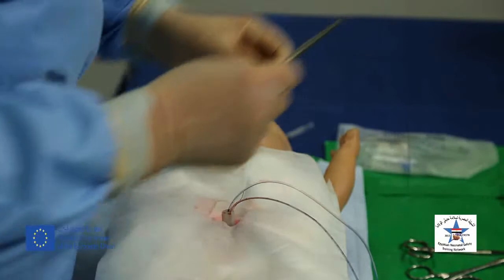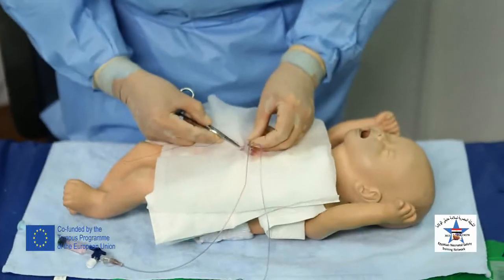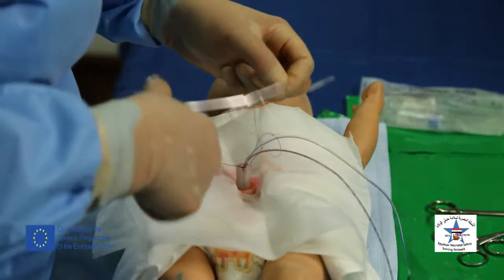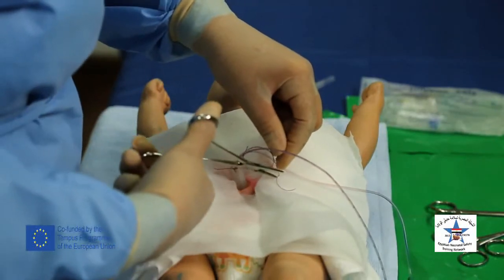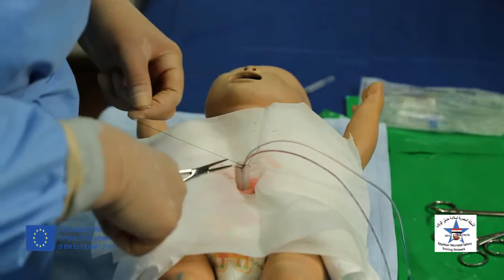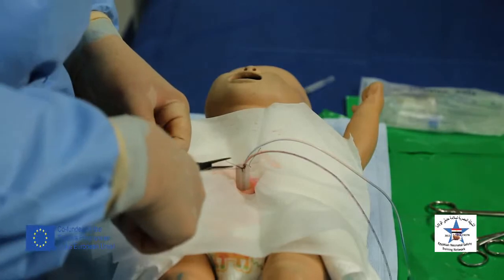Stitch the umbilical arterial catheter in place by a purse string suture and rotating the thread around the umbilical artery to fix it in place.